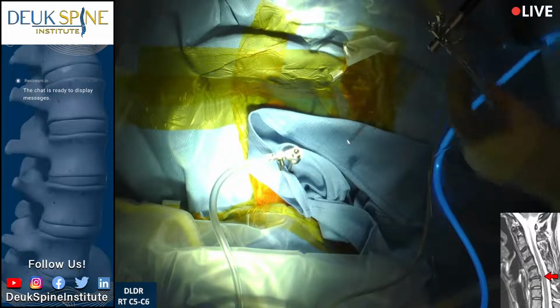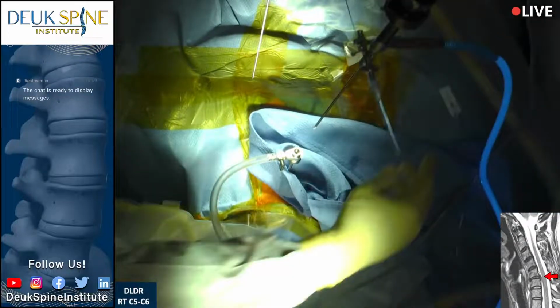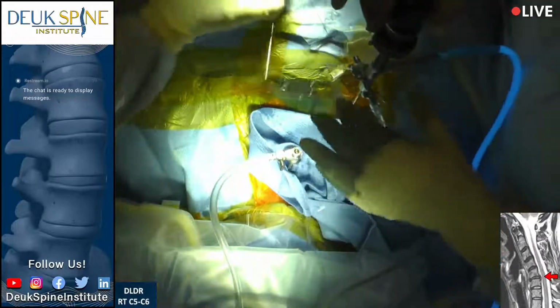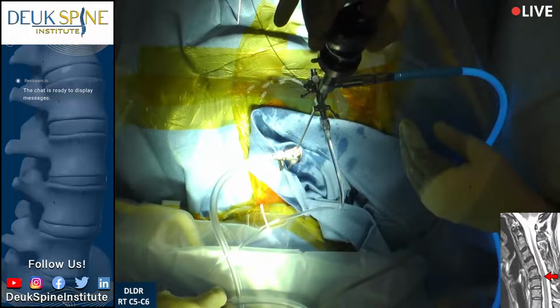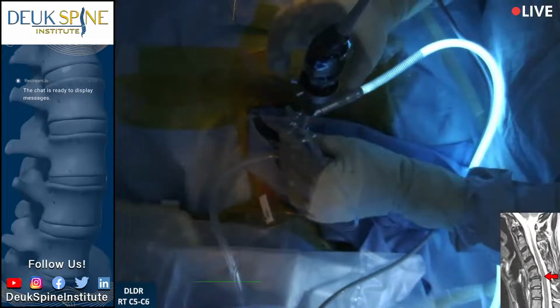Now I get a question all the time, is the Deuk laser disc repair surgery FDA approved? The answer is yes. It's FDA compliant, meaning that everything we use here in terms of equipment, medication, supplies, is all FDA approved. Even the laser.